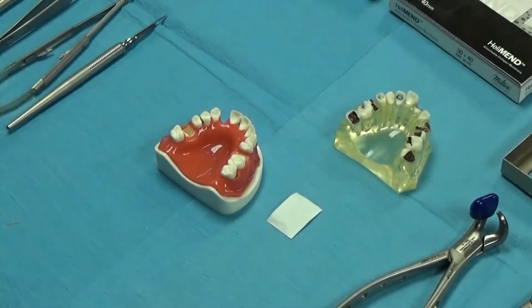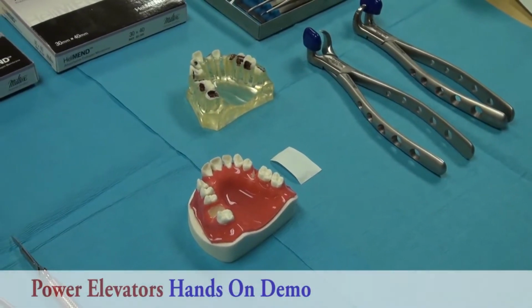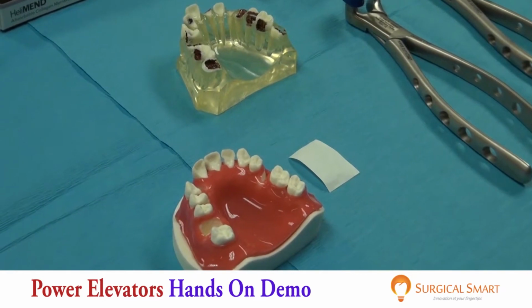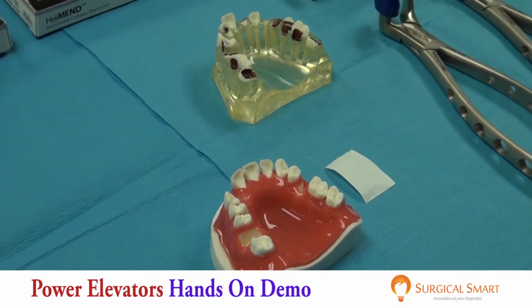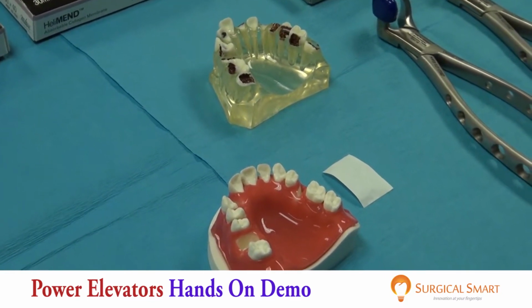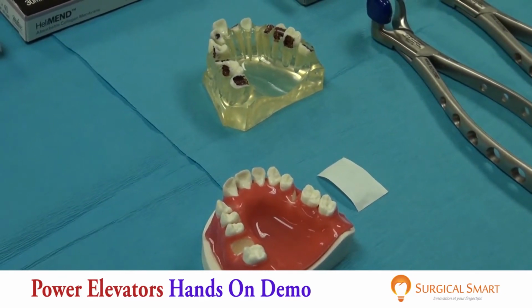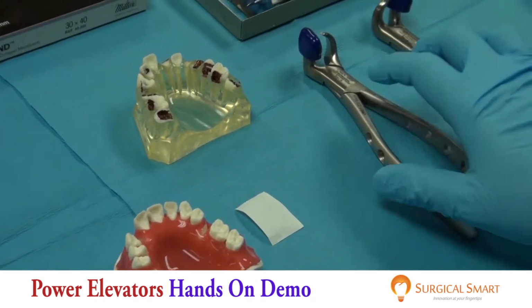Hi everyone. So to talk about the armamentarium that we use for the atraumatic extraction course, there are a few armamentarium tools that I want to bring to your attention. These are what I consider to be the workhorses of atraumatic extraction. Sure, you can invest in fancy gadgets to perform your extractions. However, these are what I consider to be the main workhorses of atraumatic extraction. These are called power elevators.